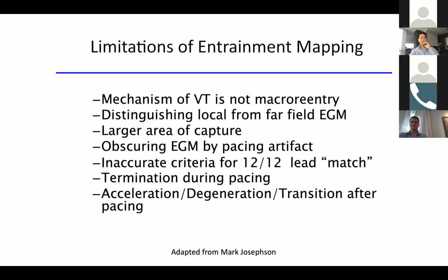All right, this is borrowed from the late Mark Josephson. I stole it exactly, didn't even try to change it to honor him. Mechanism of VT is not macro-reentrant. That's the number one. Everyone always says, did you guys do entrainment? What they mean to say is, did you do overdrive pacing?